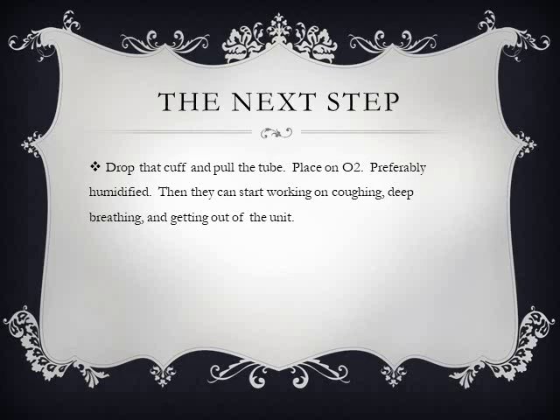Let's extubate. Drop the cuff and pull the tube. Put them on O2, preferably humidified. Intubation, extubation, I mean, that's fairly traumatic to the airway. Cool mist can help with inflammation. You always want to make sure that stridor is not an issue.